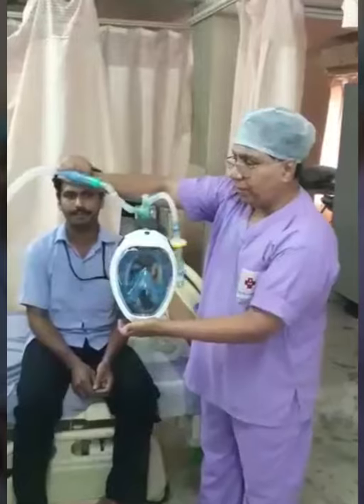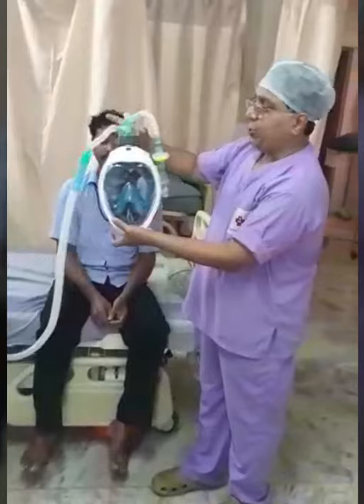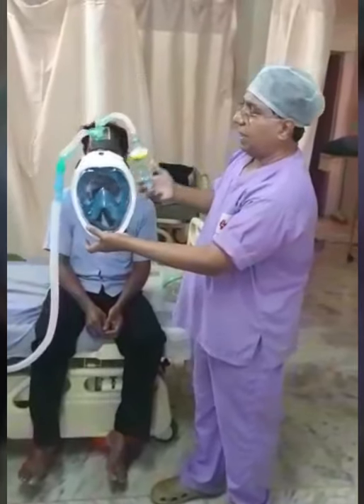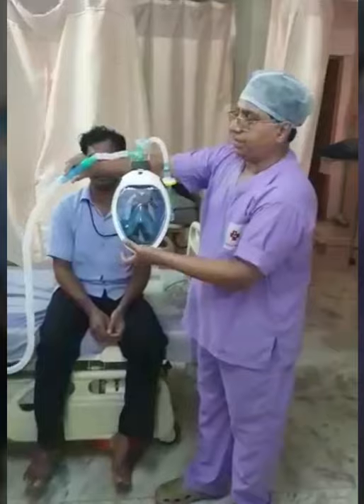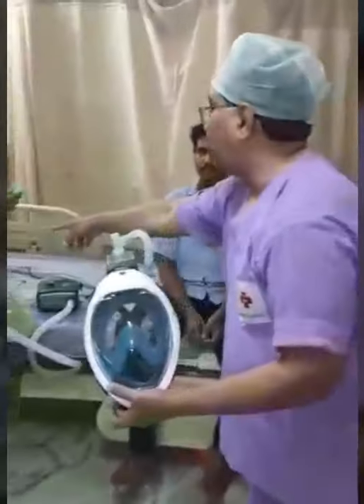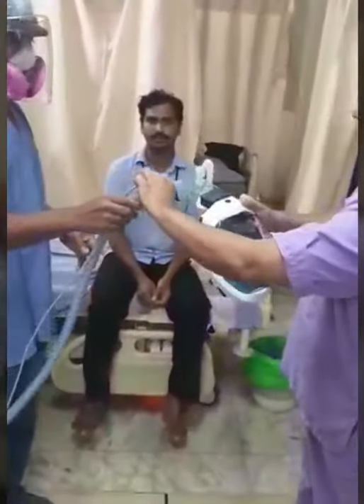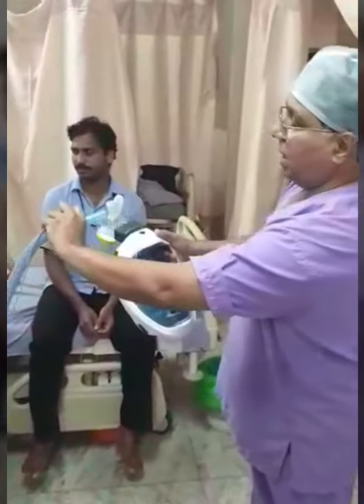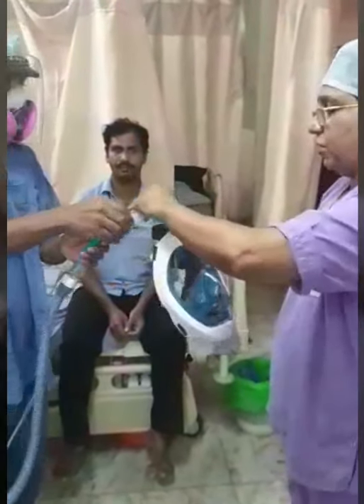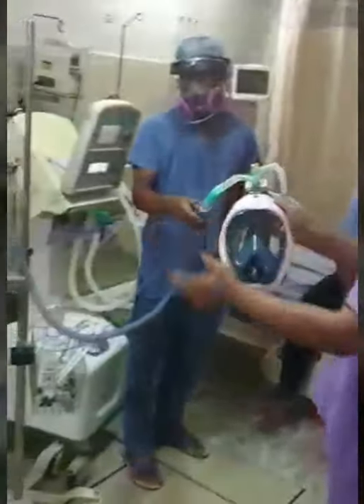If you have a single hose ventilator, this is how it has to be connected: you need a two port connector, a mechanical PEEP valve, and two catheter mounts. In case you have to connect it to a high flow oxygen device, all that you have to do is take the high flow oxygen device connector, remove the nasal cannula, and fix it with a catheter mount onto the snorkeling mask. With this, the patient will get high flow oxygen as per your settings.